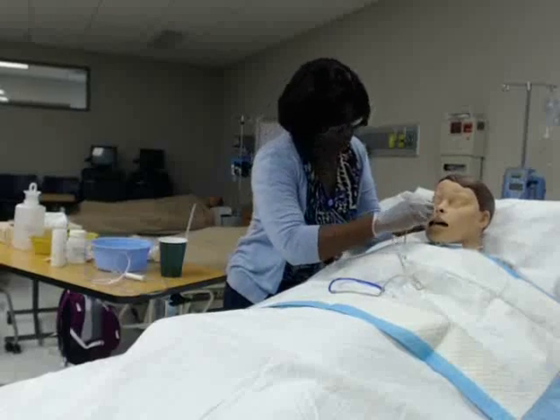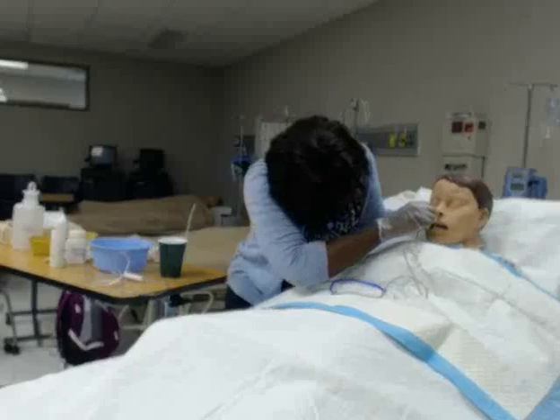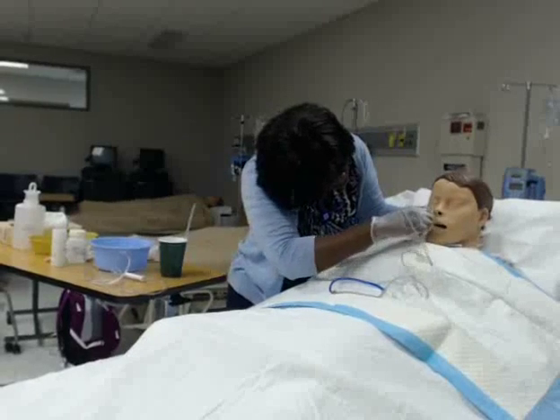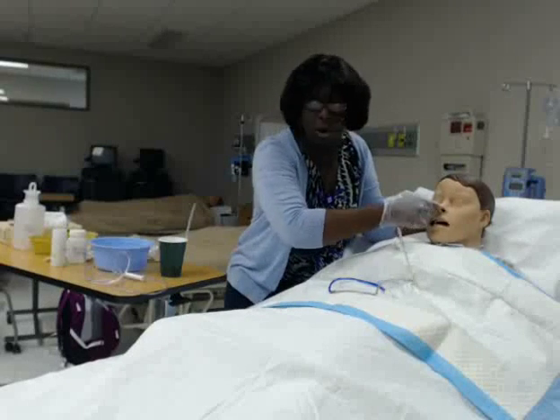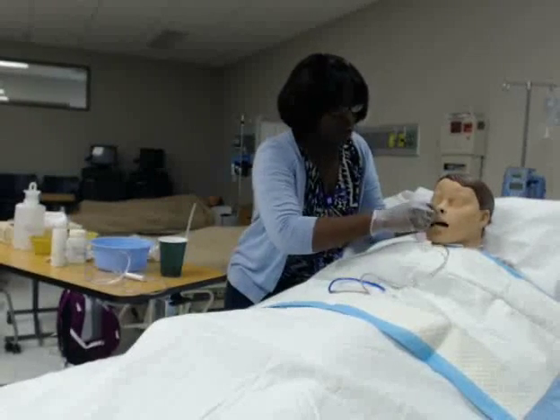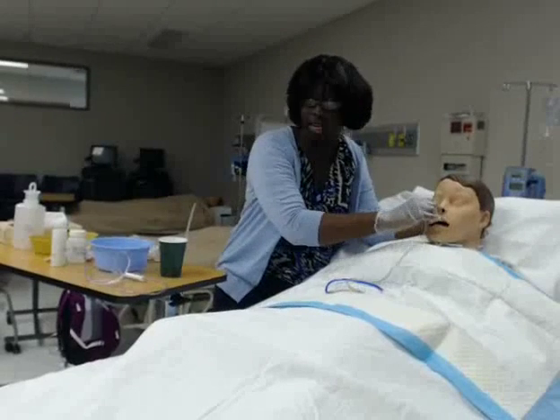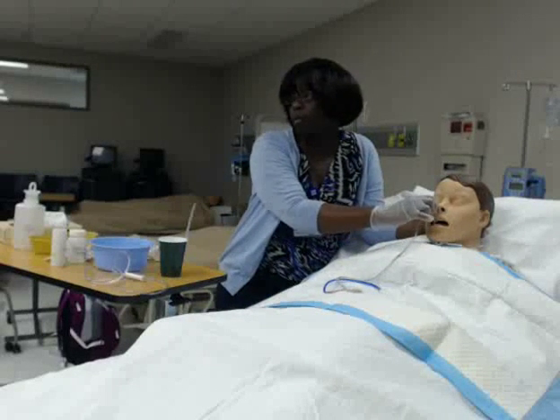Sometimes you might meet resistance. When you meet resistance, just give it a little twirl and it should continue to advance. If your patient starts getting hypoxic, or if they're really coughing and gagging a lot and seem to be in distress, you want to stop the procedure and remove it right away.